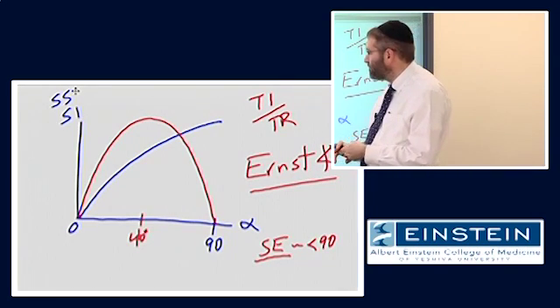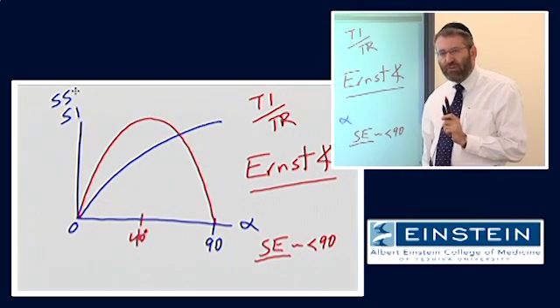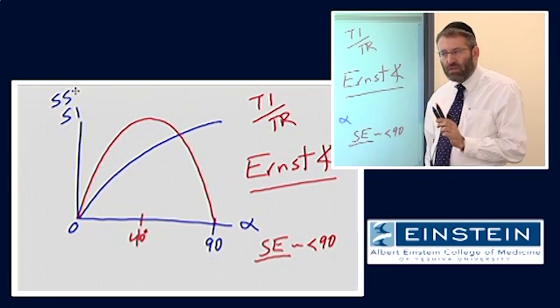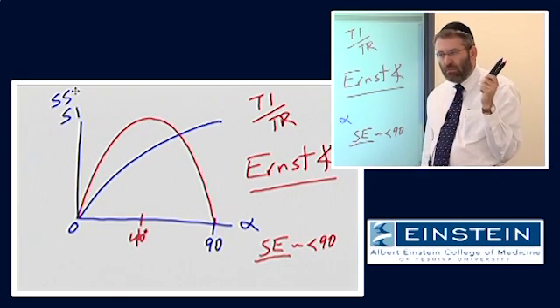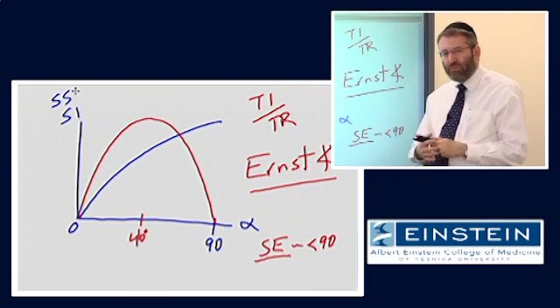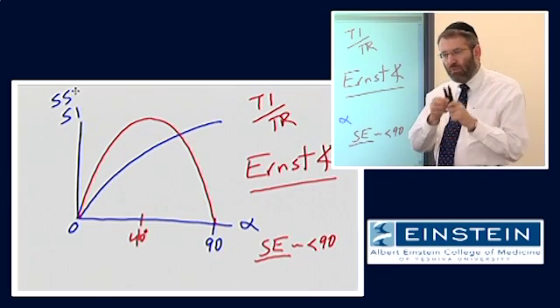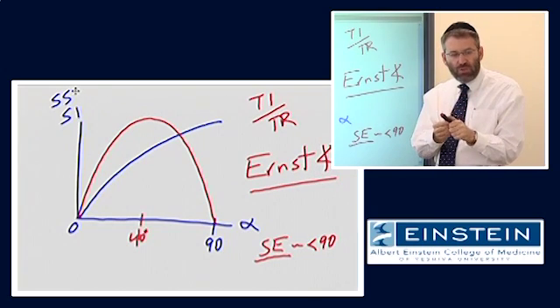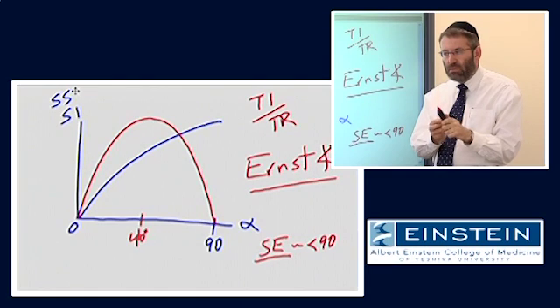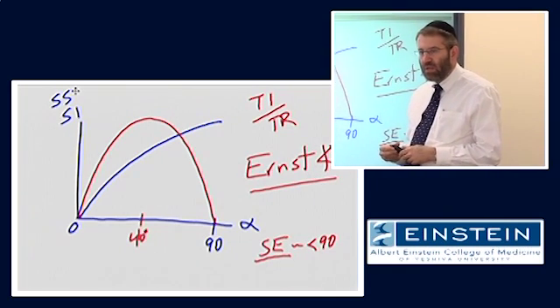So it turns out that, first of all, this will only have this effect if we're imaging with a short TR. Because if you're imaging with a really long TR, everything fully recovers and there's no T1 contrast anyway. So we can, in a sense, think of the fact that we have a short TR image which should have a lot of T1 contrast. But if we make the flip angle narrow, we are suppressing the T1 contrast that would otherwise be in the image.